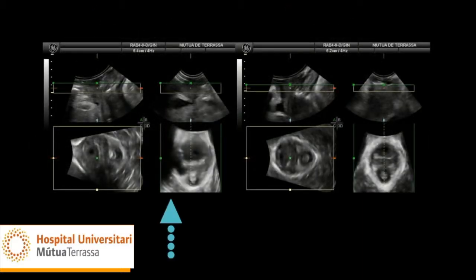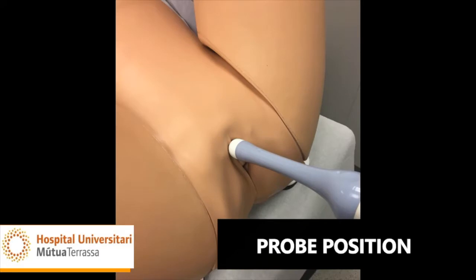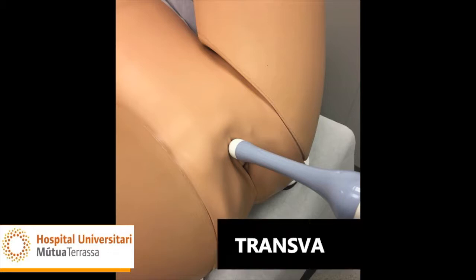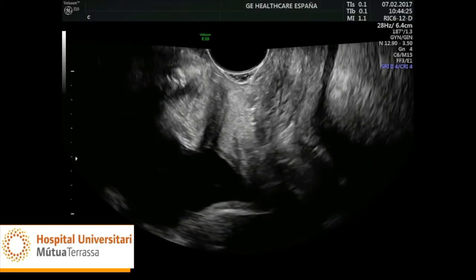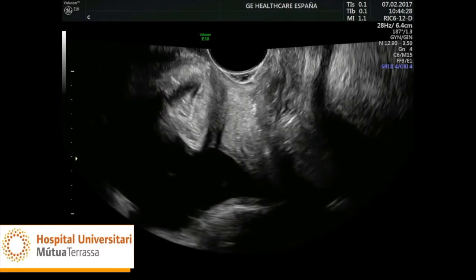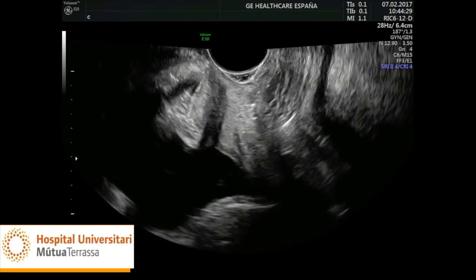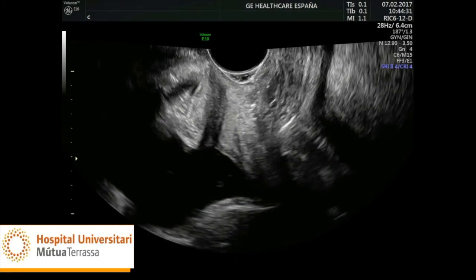The transvaginal probe can be used for 2D, 3D, and 4D ultrasound. It should be positioned at the introitus below the urethral meatus. The advantage of the transvaginal probe is that it functions at high frequency, allowing clear visualization of the structures close to the transducer. Its disadvantage is that when there is a prolapse of pelvic structures, the transducer is expelled from the introitus.